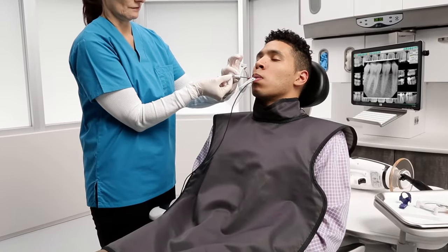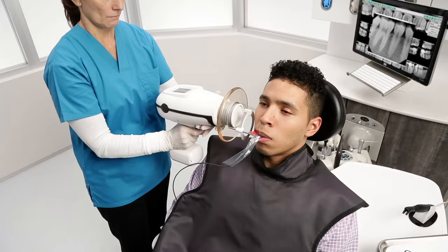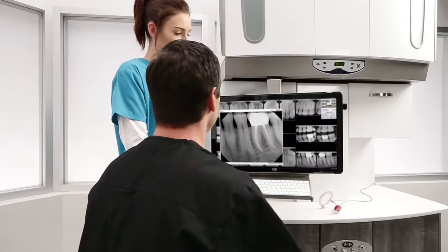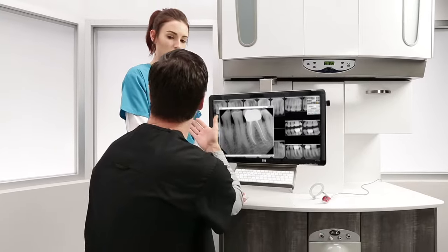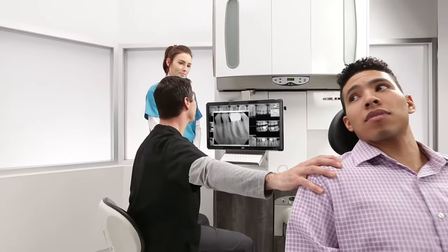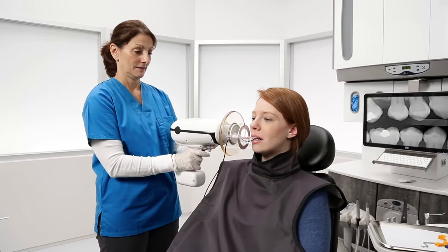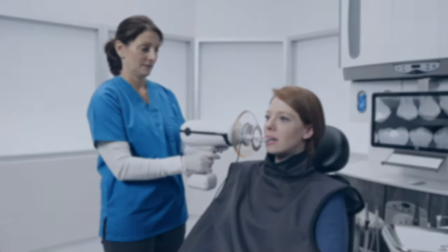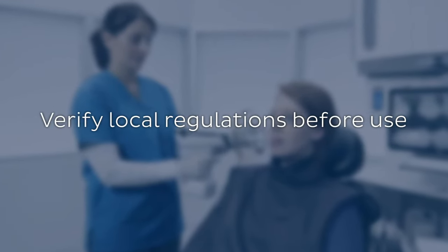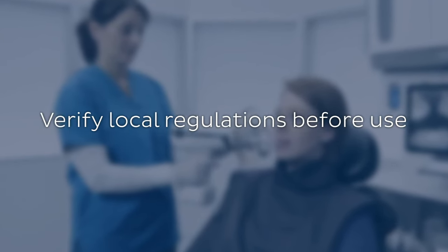Thank you for choosing the CAVO Nomad Pro 2 as your x-ray solution. The purpose of this video is to educate you on techniques for safe handling of the Nomad for you, your patients, and for the public. This video is intended as a supplemental training to your manual. It is also advised to take the operator's exam included in the training materials. In some jurisdictions, the successful completion of an operator's exam is required before use. Please consult with your jurisdiction for specific requirements.